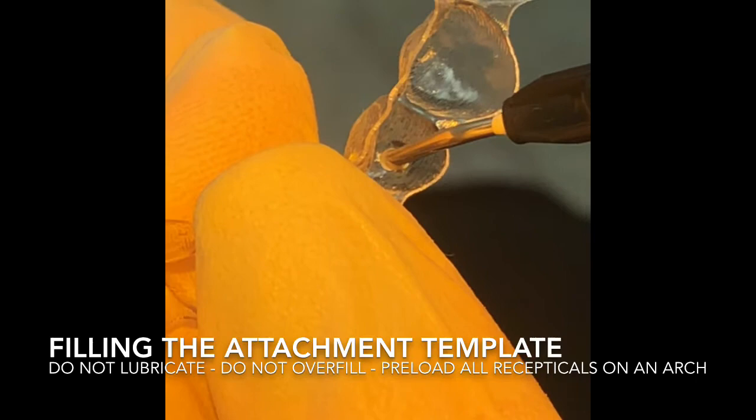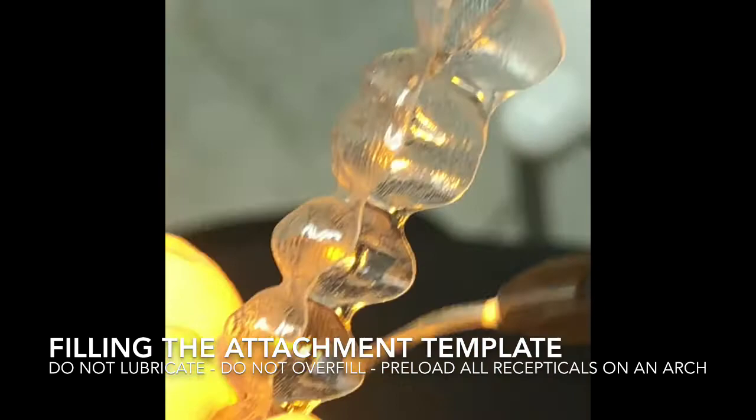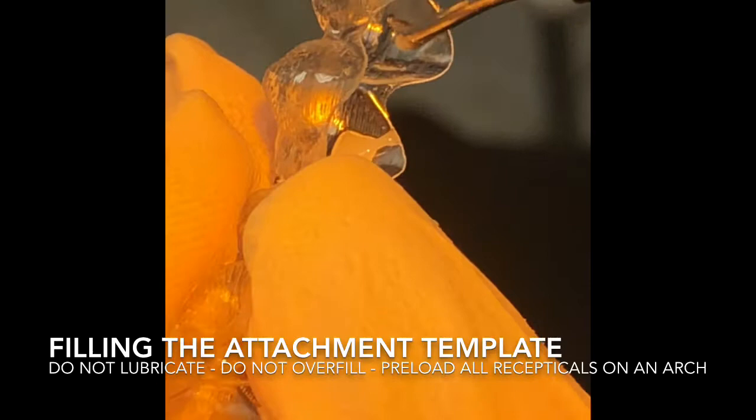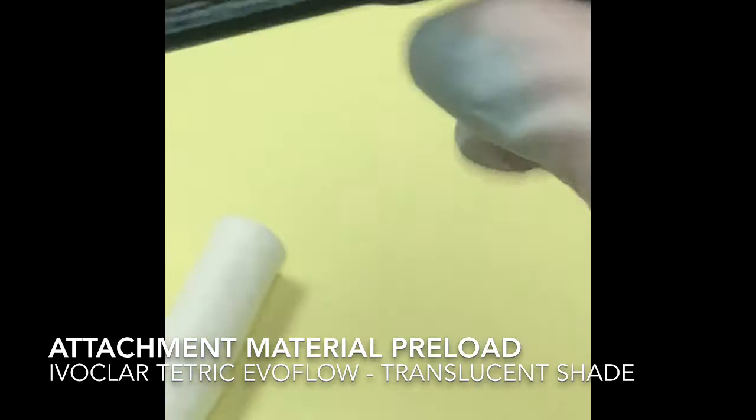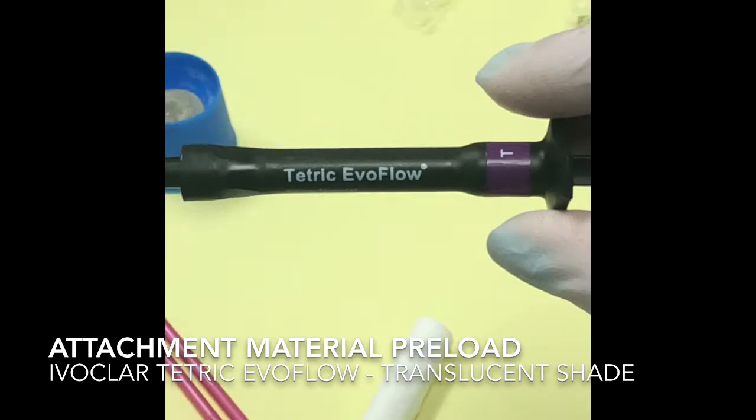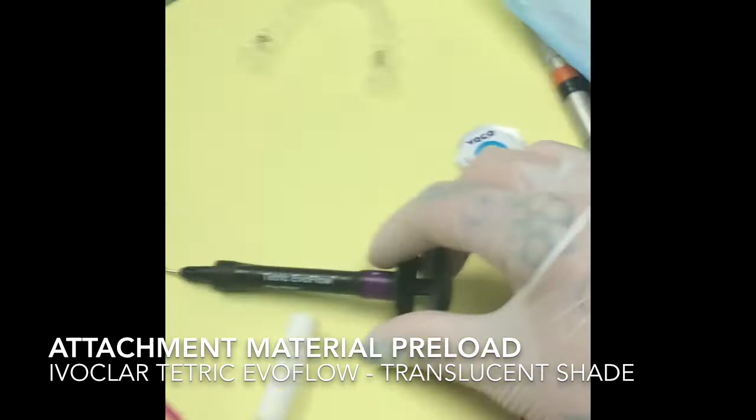Nice steady hands - didn't have too much coffee today? Only one Dr. Pepper - this is Texas, so Dr. Pepper, 23 flavors. We're using Tetric Evo Flow transparent. We love transparent because it makes these attachments invisible. Patients don't love having attachments on their teeth, so we can minimize them and make them transparent. That's the preloaded upper aligner, covered up so the room light doesn't set it up.